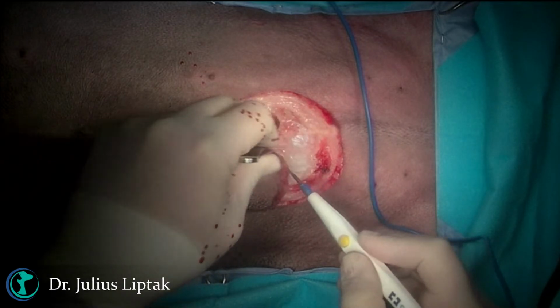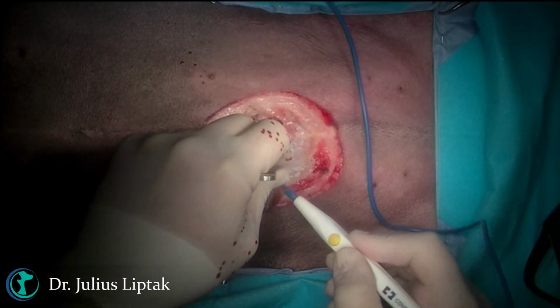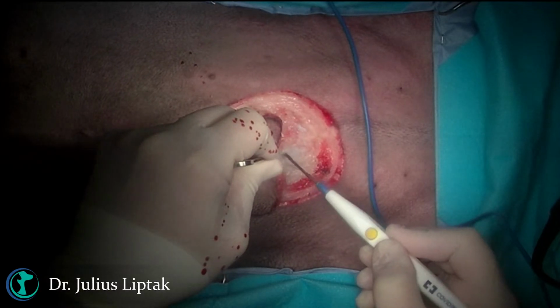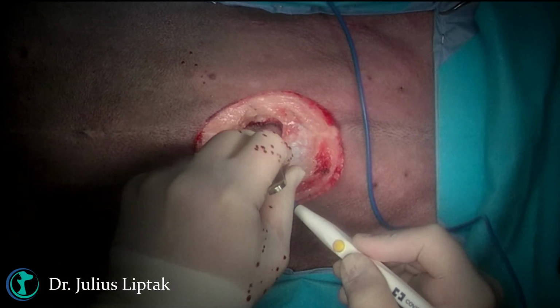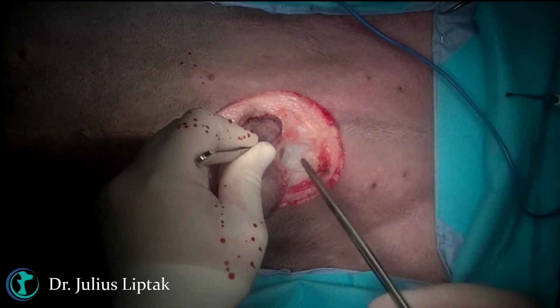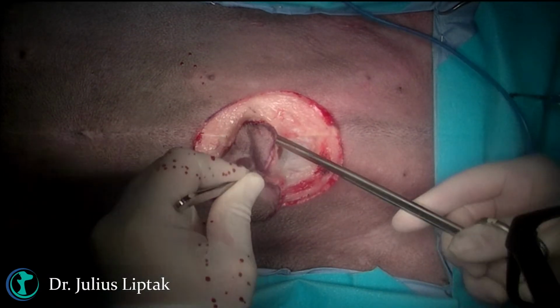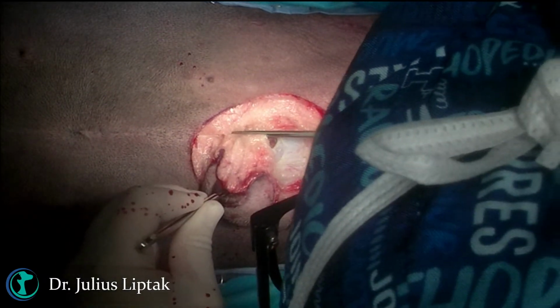And so here's the fascial margin down here. So I'll pick that up and come under that fascial margin like so.